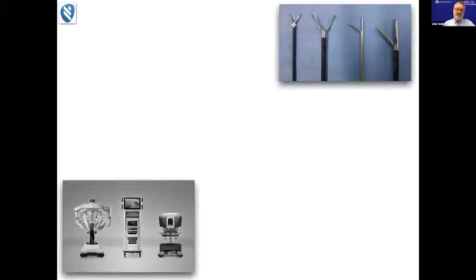And there's actually a huge gap between the large robotic systems and the really terrible laparoscopic instruments that we all use today. These are instruments that were invented about 45 years ago, even before laparoscopy, mostly for ENT procedures, and then made a little longer. And this gap needs to be filled by a lot of things.